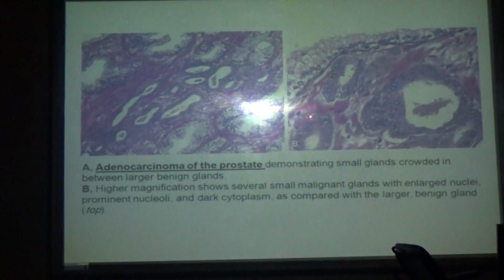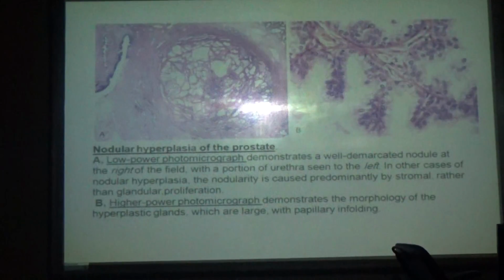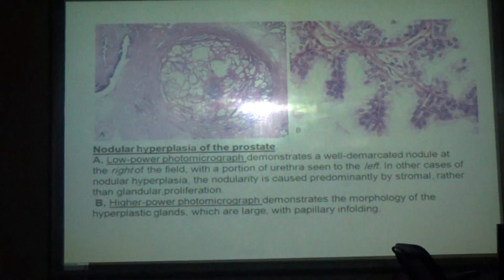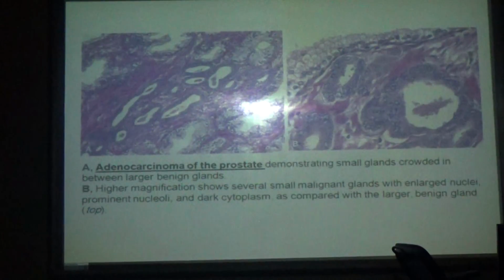Prominent nucleoli. It's clear, this one? Along with this, I will keep this picture so that you won't miss it. Yeah, a prostatic carcinoma lesion also.